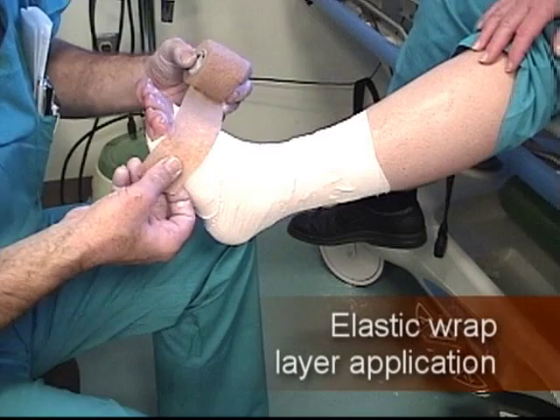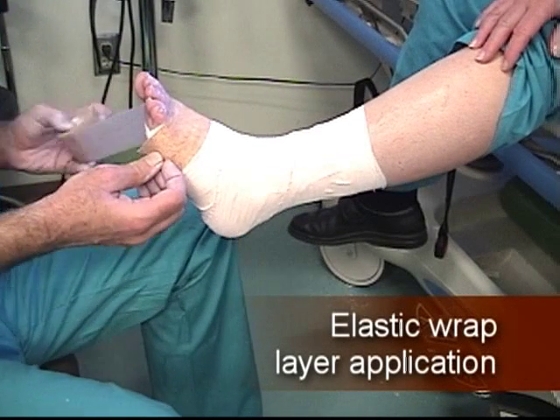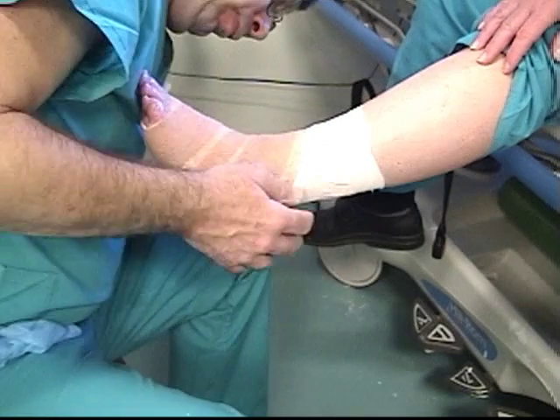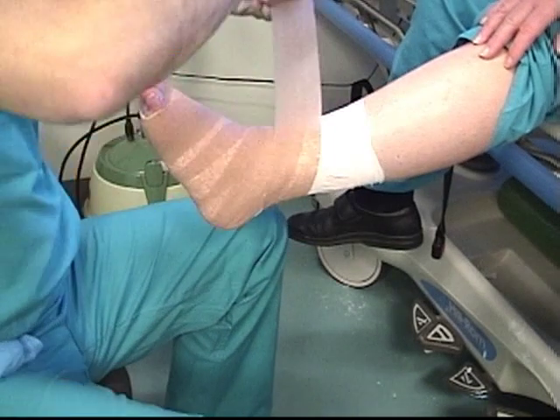Once the Unaboot is applied, wrap a second layer around the entire Unaboot to secure it into place. Use an elastic wrap material for the second layer.